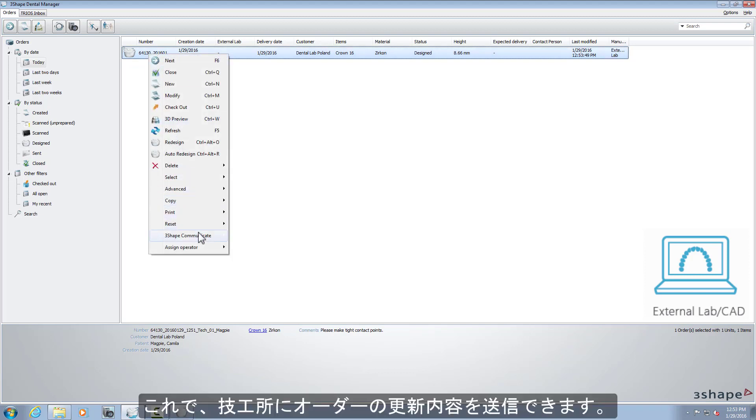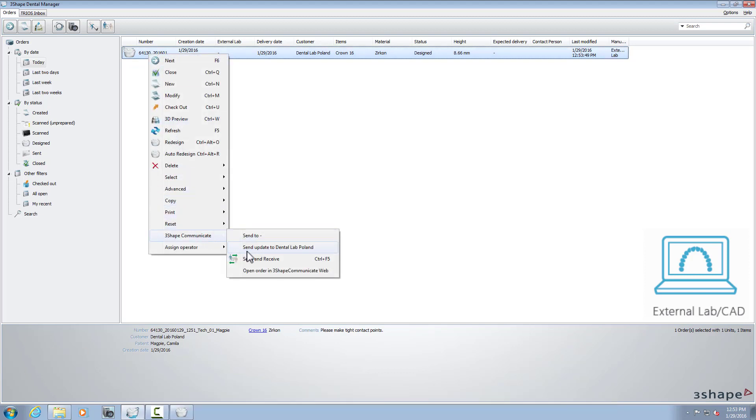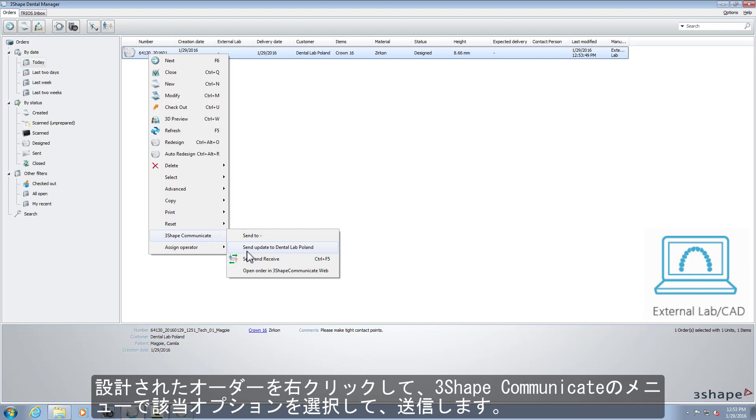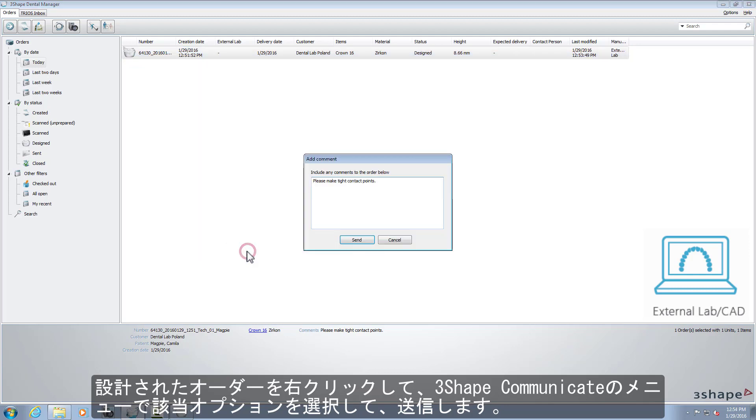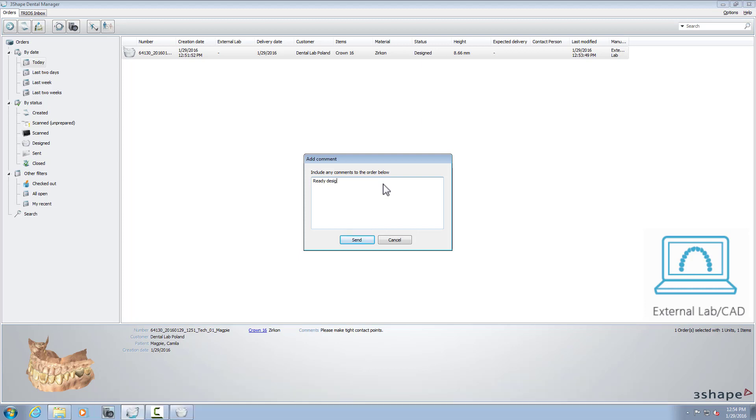Now you can send an update to the work lab. Do it by choosing this option in the 3Shape Communicate menu, after right-clicking on the designed order.